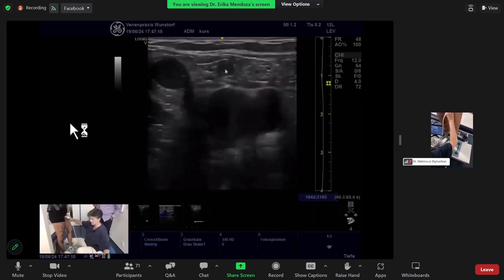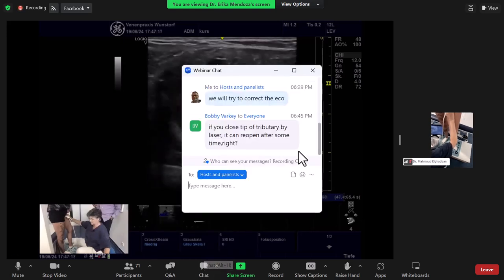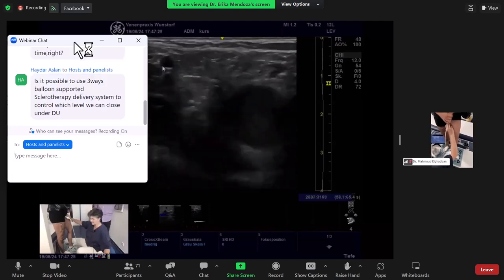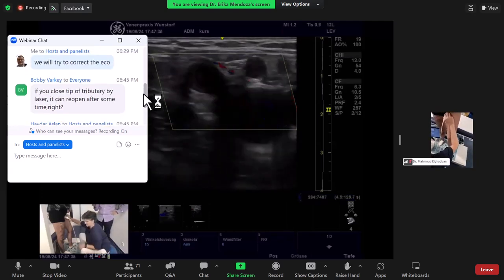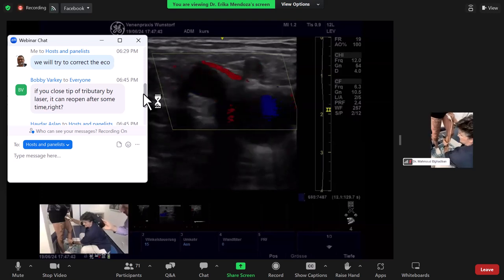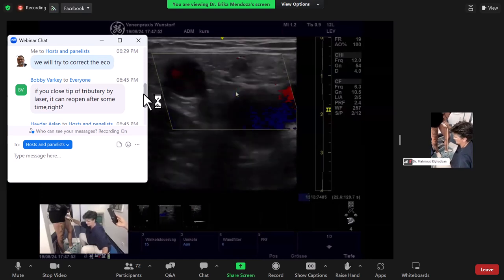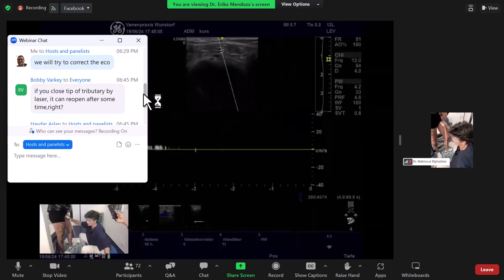I go up, and we have the accessory coming from above. So we have accessory and epigastric joining together into the great saphenous vein, and then we have another epigastric vein coming from medial. So we will make different investigations. There you have the wonderful artery crossing. Again, it looks like a little bit comes from the deep vein, but it could also be coming out. No, it is coming out here. We follow the tributaries. Once more, raise the toe and lower it.